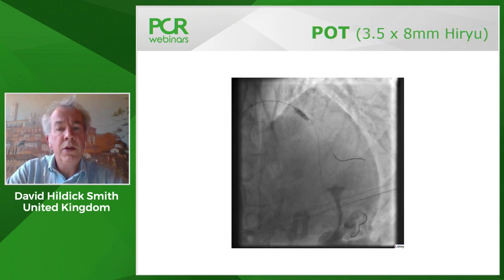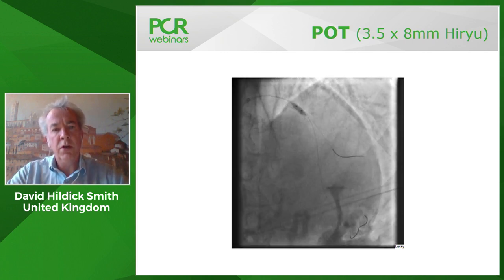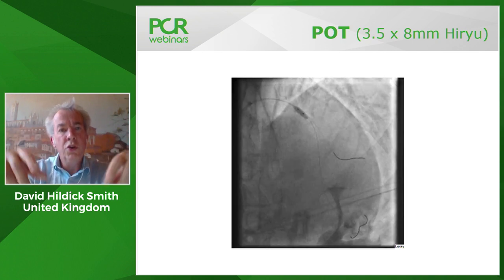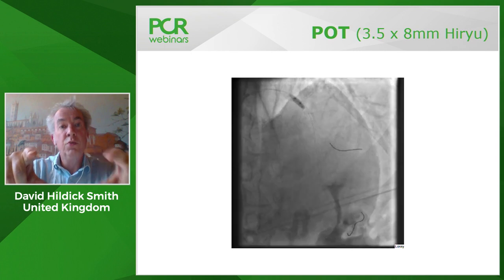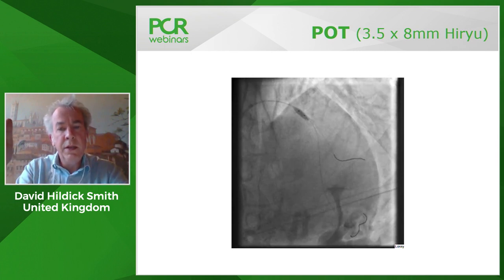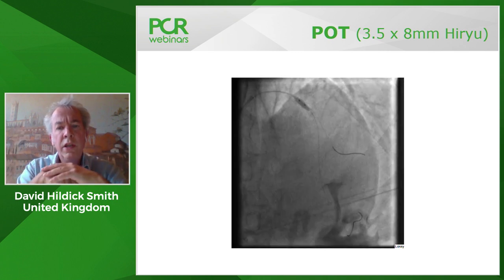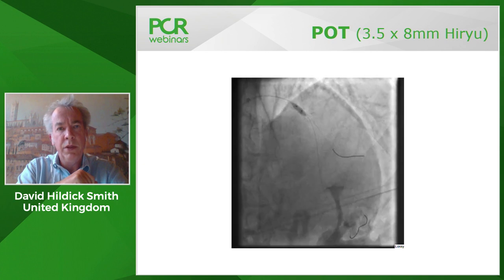Now, that may be because not both positions of the pot balloon were recorded, because, of course, you need to open the stent struts not just at the point of the bifurcation, but also back towards the very beginning of the stent. So yes, it may be that it wasn't all recorded, but looking at that one image, it looks as though we aren't quite up to the carina with the pot balloon.